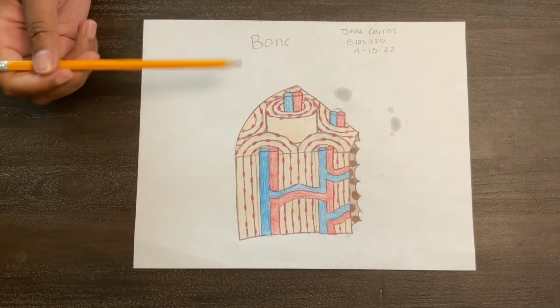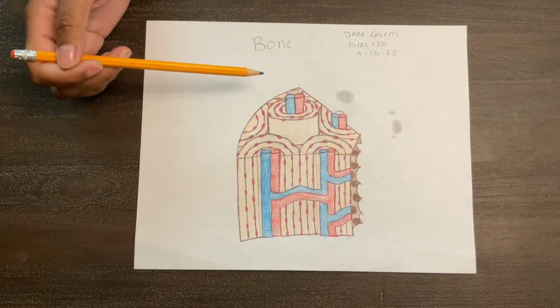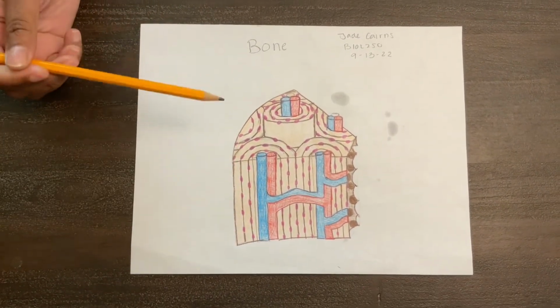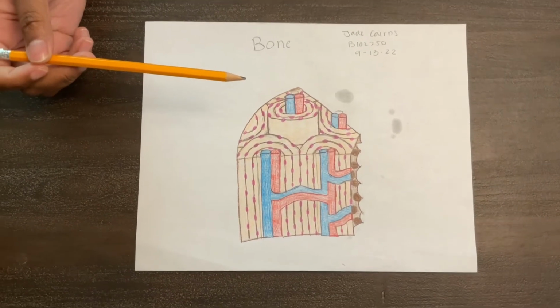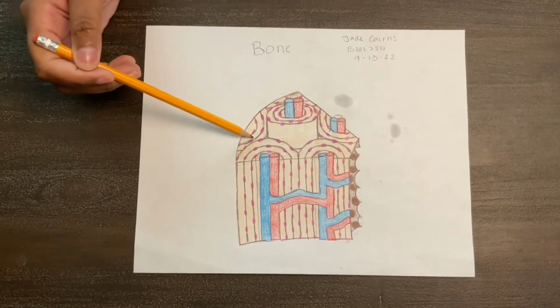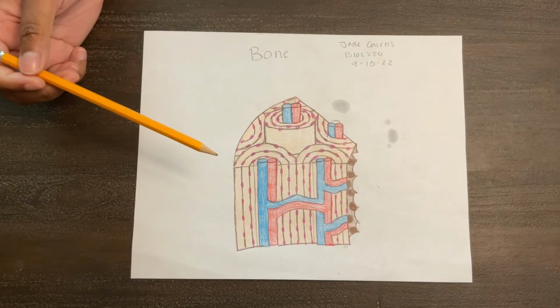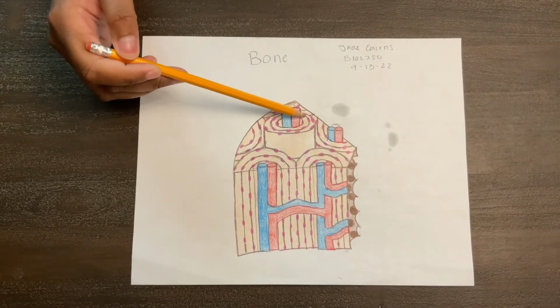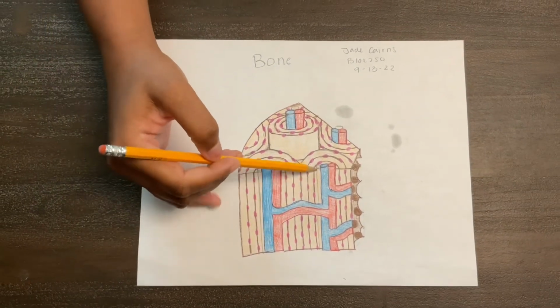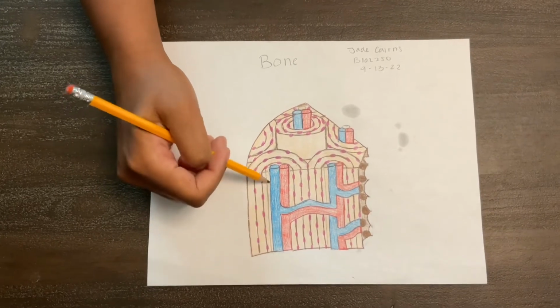The canaliculi is right in here. The central canal is right in here. The circumferential lamellae is right in there. The lacunae is right back here. The nerve is this beige portion that goes right alongside the blood vessels right in here.